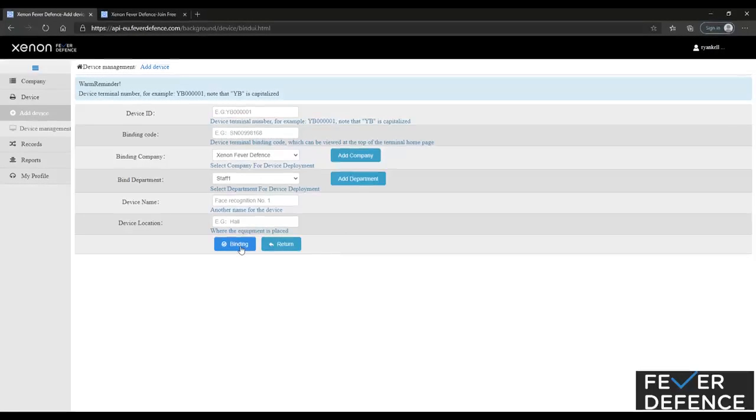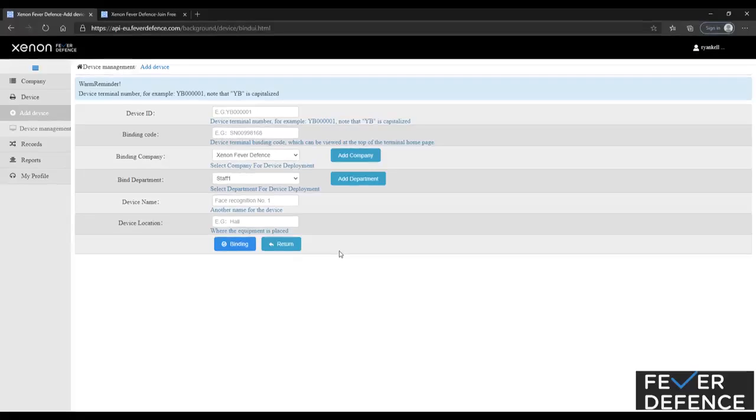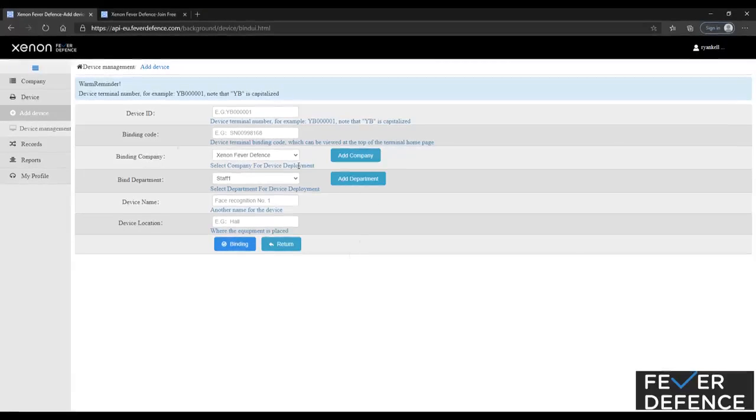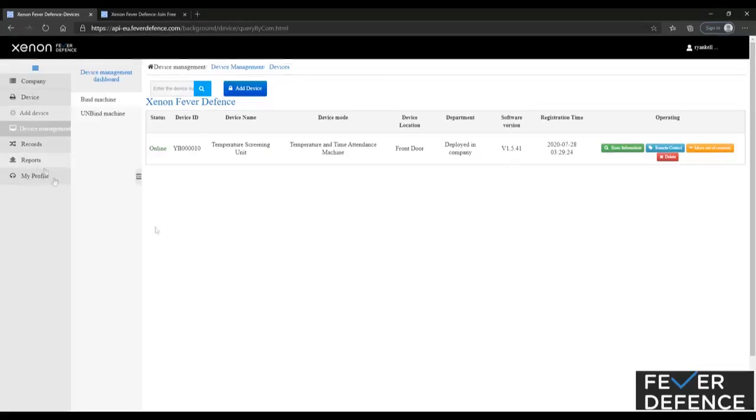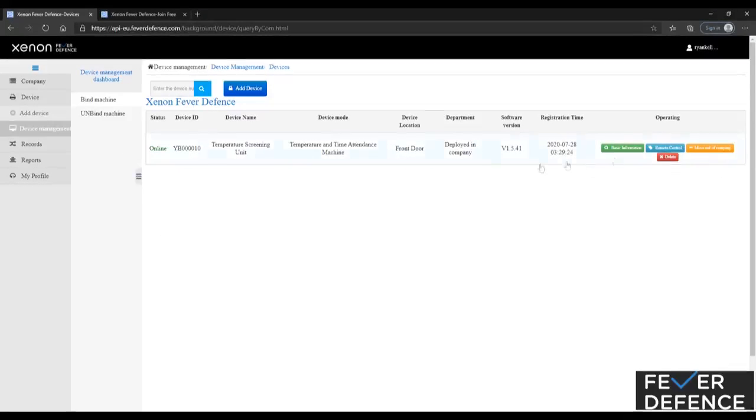So when that's done, you're going to click binding, and that device will be added to your system to check if it is added to your system. You're going to go to device management, you're going to select device management, and your device will show here.